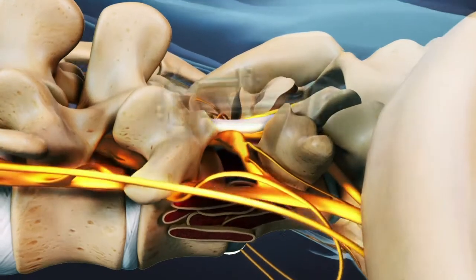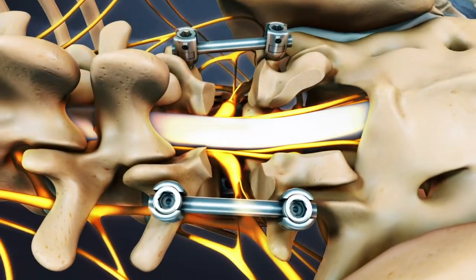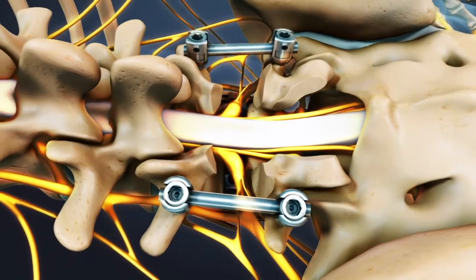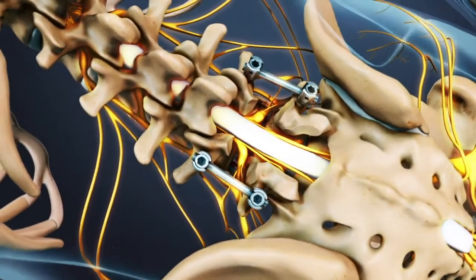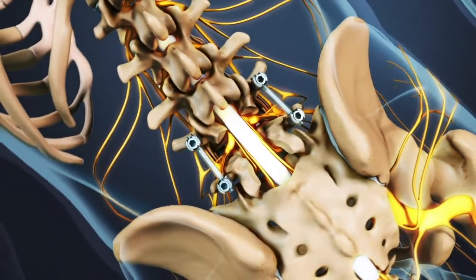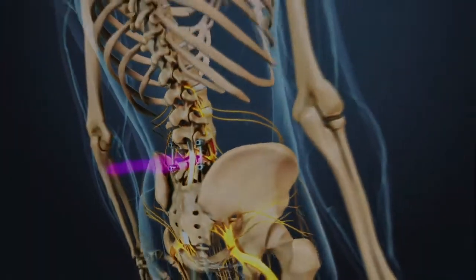The surgeon may implant a series of screws and rods to the back of the spine for additional support. A PLIF fusion may be supplemented by a simultaneous posterolateral spine fusion surgery. In addition to open surgery, a PLIF may sometimes be done through a tube in a minimally invasive approach.